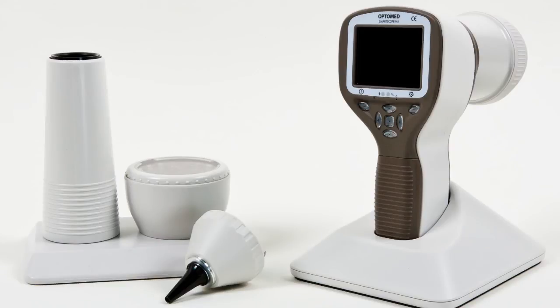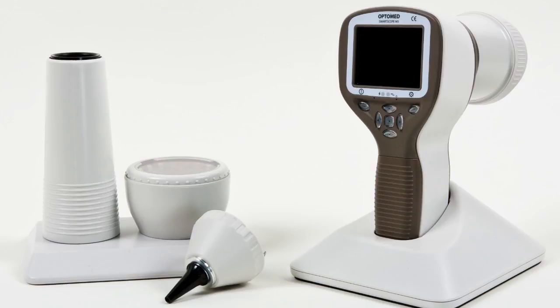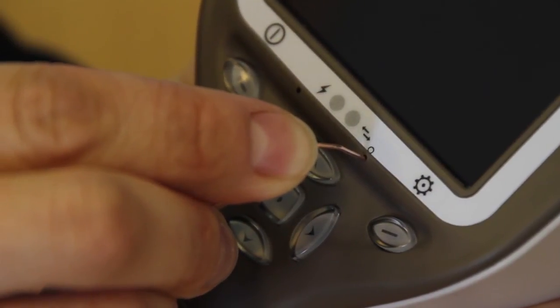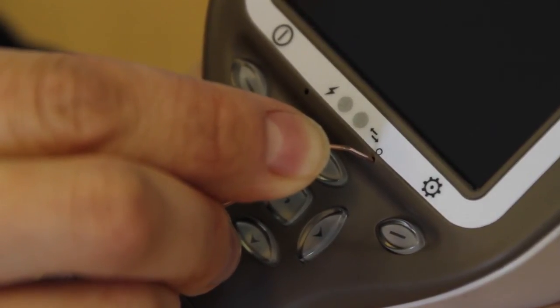In problem situations, there are two options to reset the device. You can restore the original factory settings by selecting Restore Factory Settings in the device menu. If the device is behaving abnormally, a reset button can also be used. The reset button is located in a small opening under the display, marked with a circle, and can be pressed with a thin object such as a paper clip — it needs to be held for over 7 seconds.